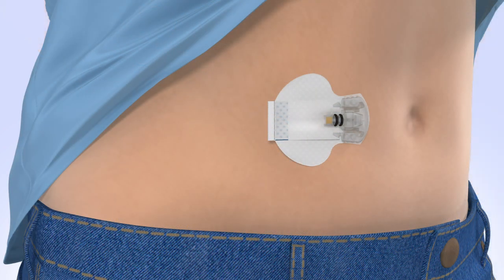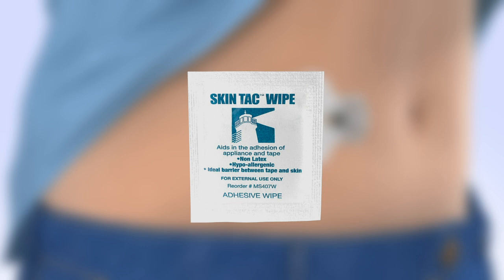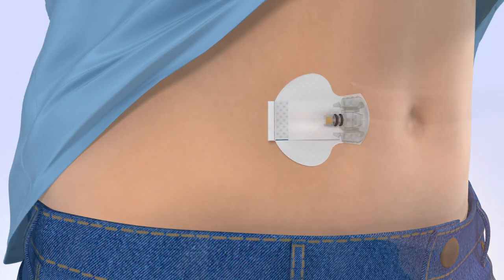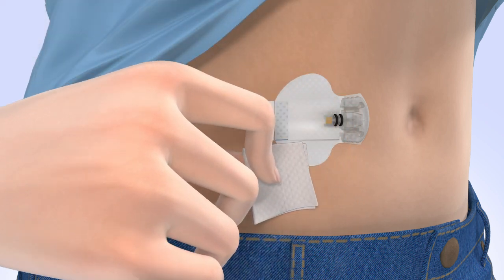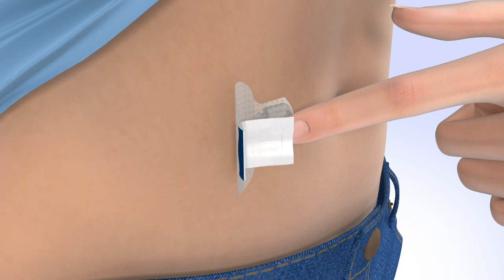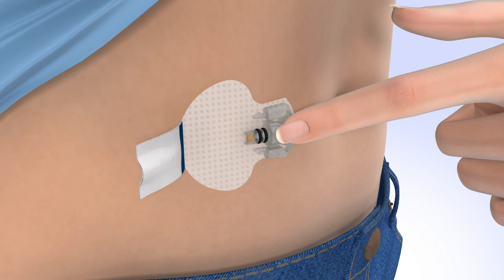Now that your sensor is inserted, you may use an optional liquid adhesive such as SkinTac to help keep it in place. To apply the adhesive, open the packet and remove the SkinTac wipe. With one hand, gently lift the adhesive pad while keeping your fingers on the sensor base to prevent it from pulling out. With the other hand, wipe the skin beneath the adhesive pad. Next, wipe the area around the sensor, including the adhesive pad, and wait for the liquid to become dry and sticky. Carefully remove the adhesive liner that is located underneath the curved adhesive pad and press the adhesive pad against the skin. Now flip the adhesive tab so it lies flat against the skin, but do not remove the adhesive liner from the tab just yet.